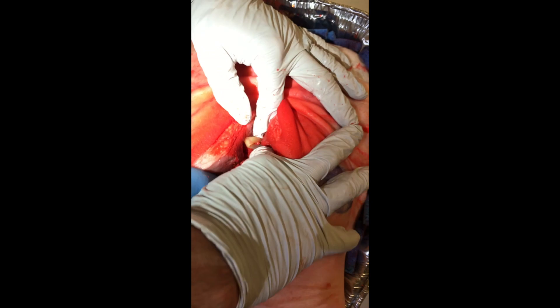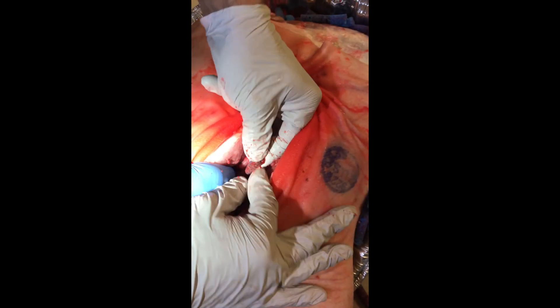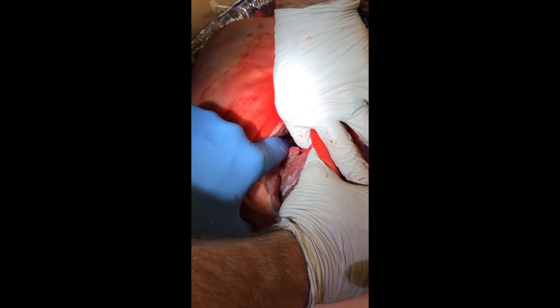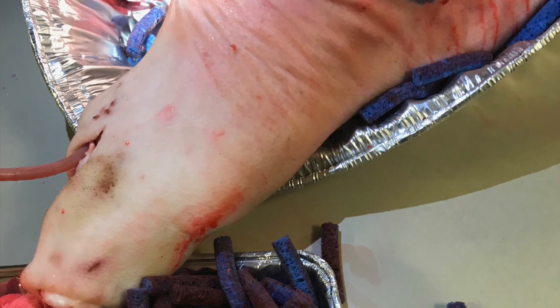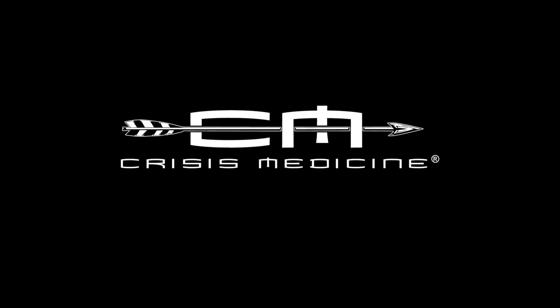Yeah, you see that? There's still more down there, still under it, still more. There's still more underneath — I see another one down in there. They went through the hole that we drilled to put the tube in. I'm not going to be able to get that one — it's very deep. That's better. To be continued.